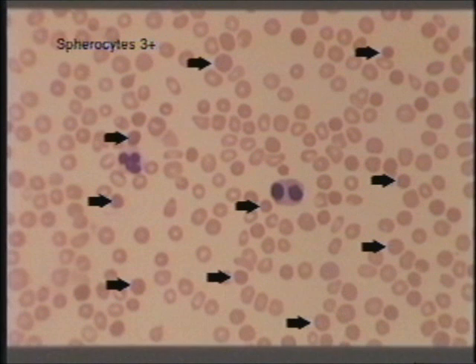Spherocytes are another splitter, a cell type that when they occur in very low numbers are clinically significant. In this patient with spherocytes, we see some definite spherocytes, but they are one of the cells that, oddly enough, when you approach it from a further view, say a lower power, spherocytes frequently stand out much more than when you are at a very high or close power.